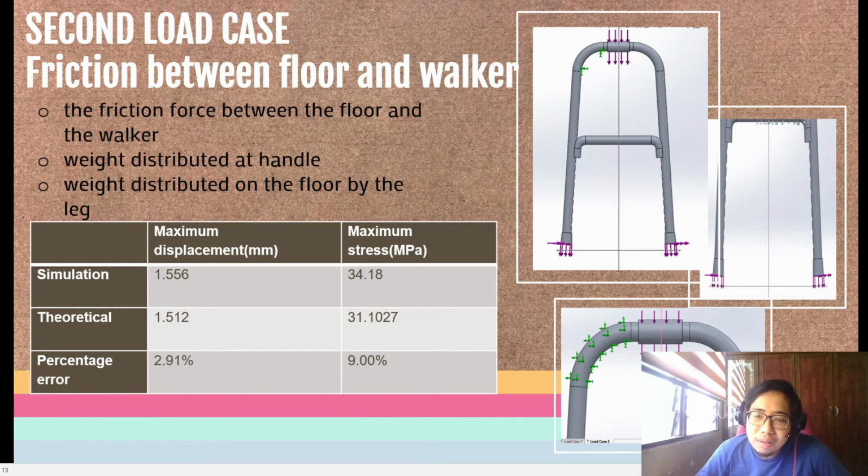As you can see in the picture, we decided to put only one fixture point, between the connector of the front handle and the walker frame. And for the forces, on the side handle, we decided to only put one downward force, that is the weight of the user. And on the leg, on the front and the back side, we can see there are two forces. One is the friction force and the downward force is the weight of the user plus the walker frame weight.